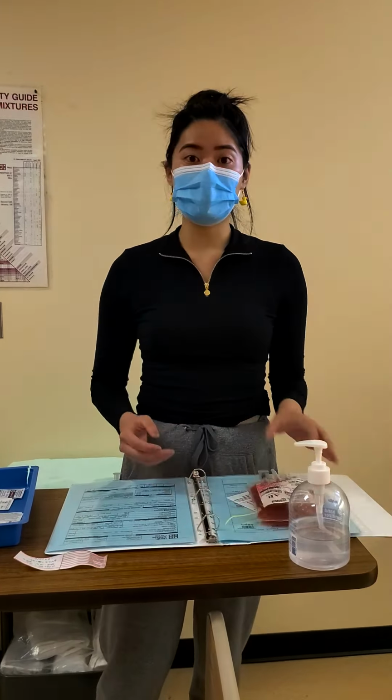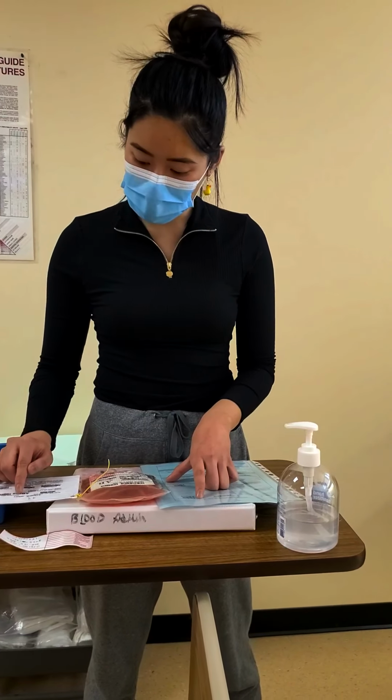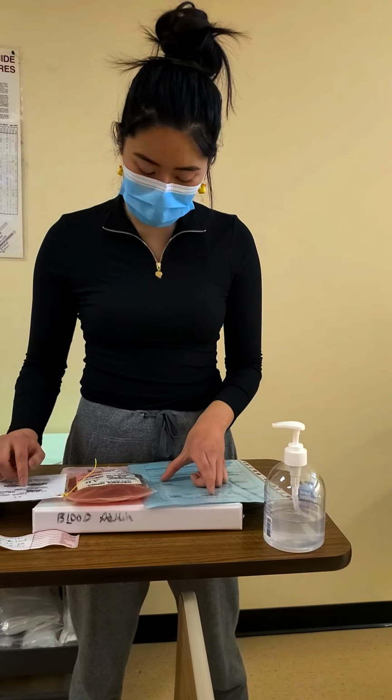And now we're going to be comparing the record of transfusion with the blood tag here. Alright, so we have our right patient, Atrique Jerry, A-T-R-I-Q-U-E, J-E-R-R-Y, VIN number 261-824-375, and now we want to take a look at our patient's blood group. So it's AB positive, the donation blood group is AB positive, so that is compatible. And we're going to take a look at the donation number, and so it's 051089900-445 and Y in a box.